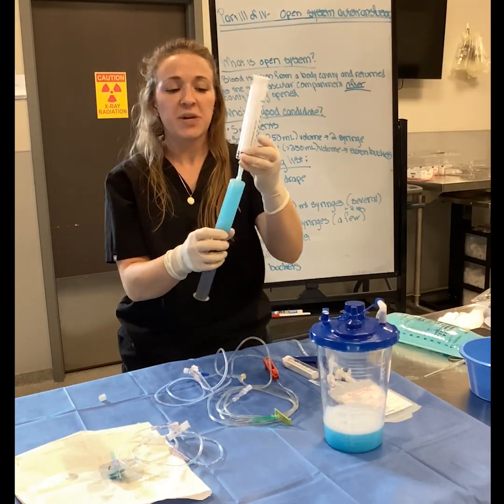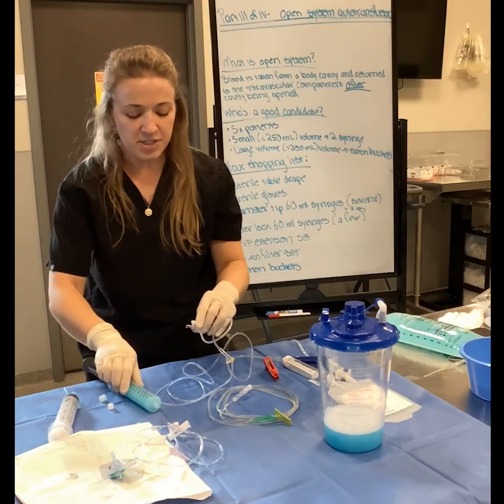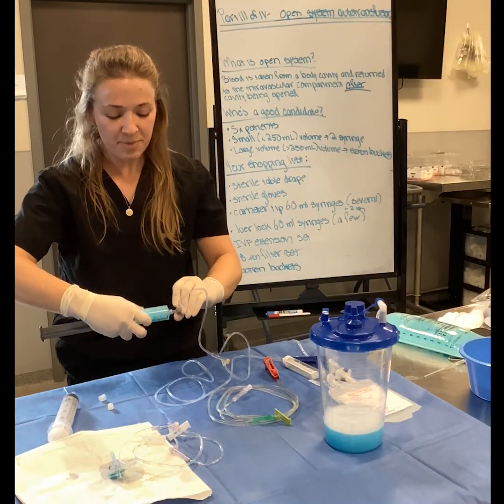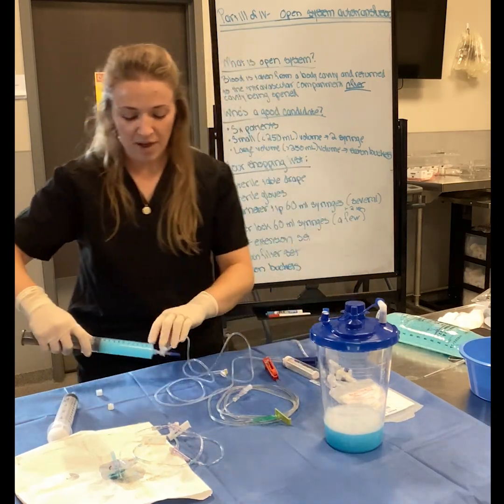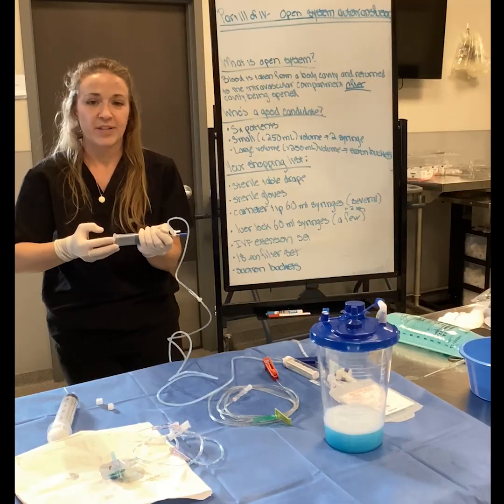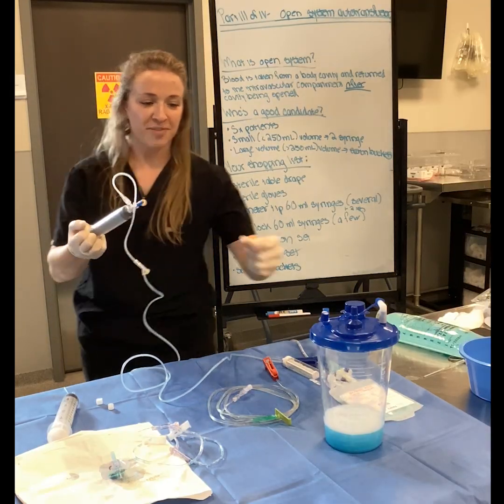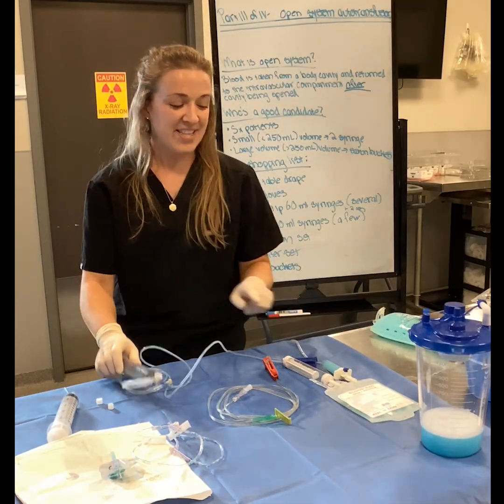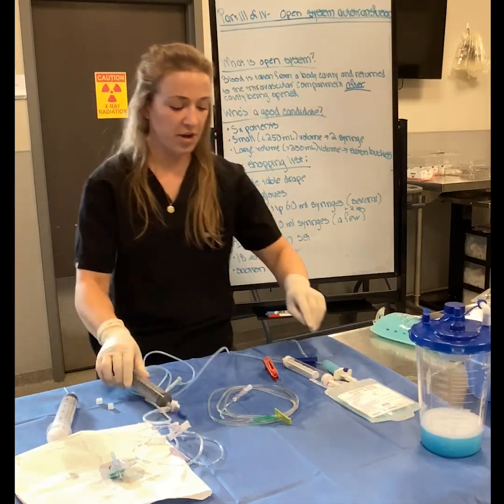I will say, just because there are gonna be drips of blood because you're working with it, it's not at all uncommon to create a mess. So get some lap pads, get some towels, wear your gloves, wash your hands. It's gonna get messy. But that's surgery, isn't it? So now, if you're looking a little carefully, and I'll take my bucket out of the way here, that's my patient's bucket, the blood has gone from the bucket into the syringe and has now gone into the bag.